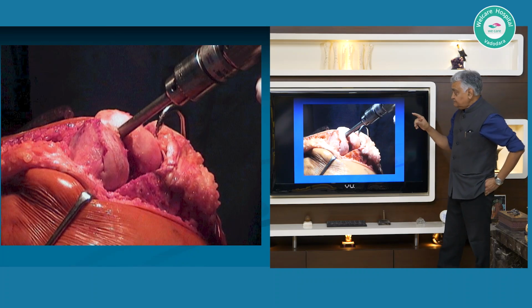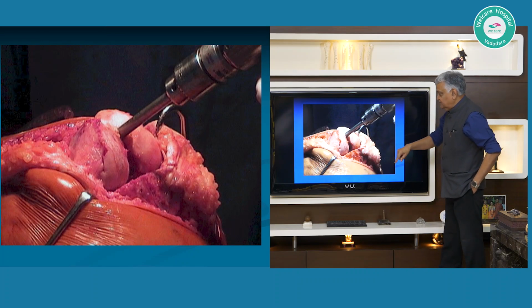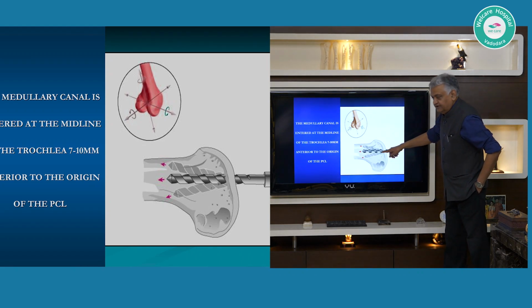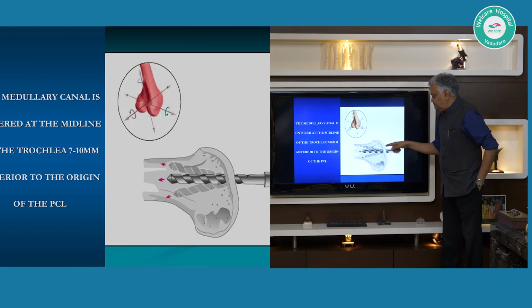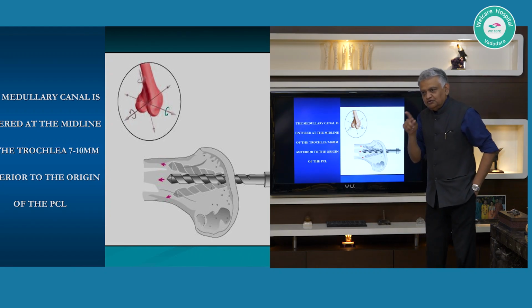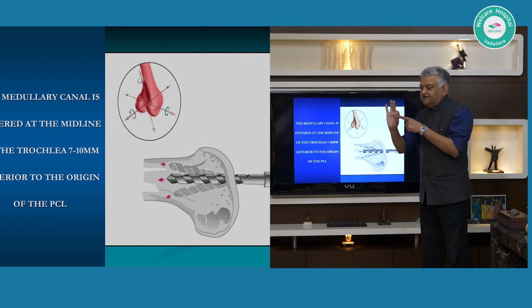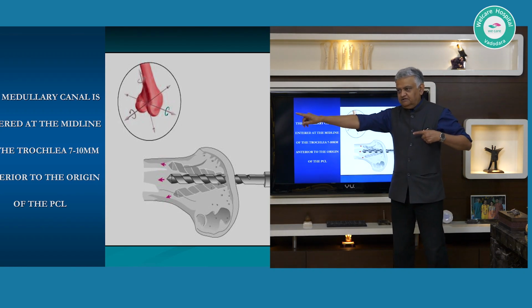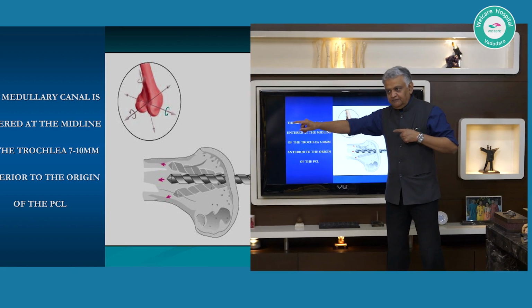Now go back one, see what is being shown here. He is putting the drill here, only a little bit, not pushing it right in, and rotating it. These two light colored things, what they are trying to tell you is open up the mouth a little bit wider, so that it is not the mouth which will dictate the direction of the rod as the real rod, the actual intramedullary rod, is pushed in.